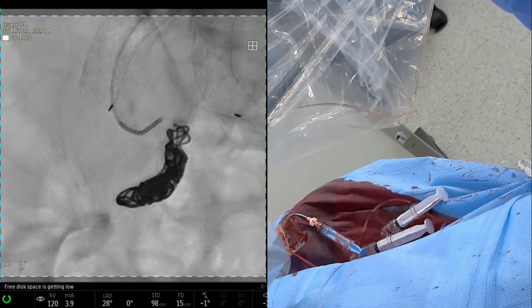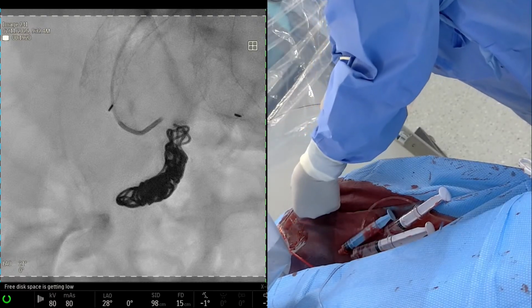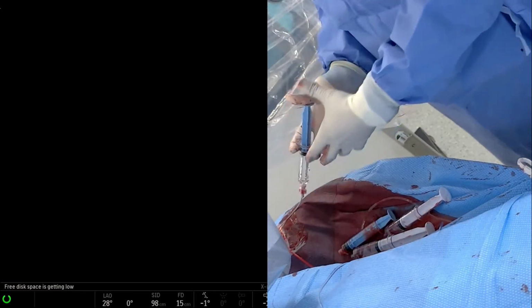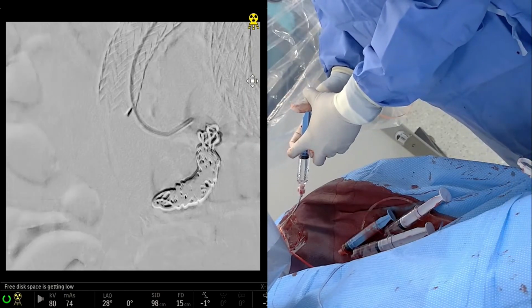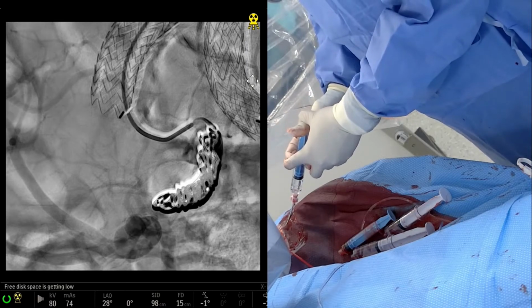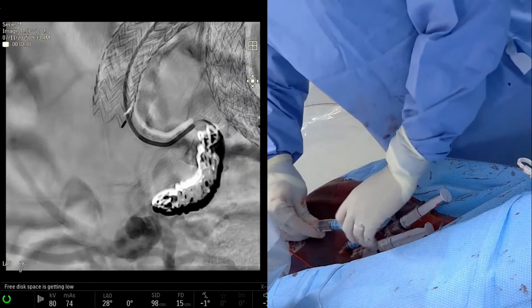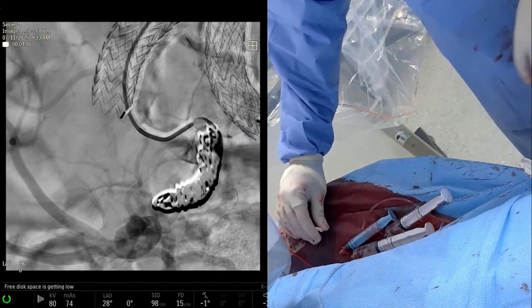Yeah, I think we see one here. So, in those cases, I'll get a microcatheter up and put a few smaller coils, if that's the case. No, I think we're okay. I think I'm getting fooled. Yeah, we may put one more. Do you have the glide wire? I'm going to try to shove this catheter back down and maybe put one.